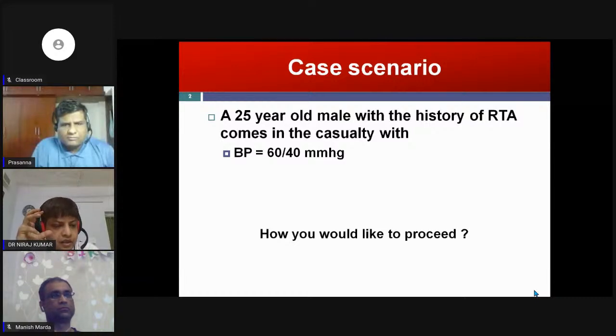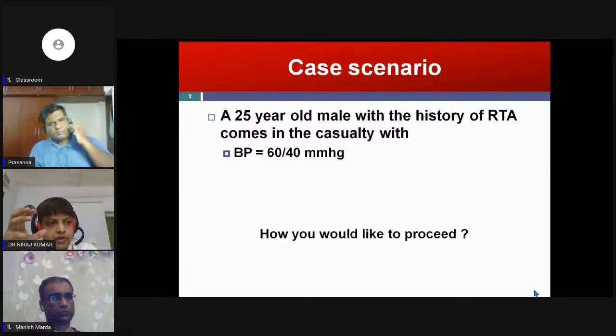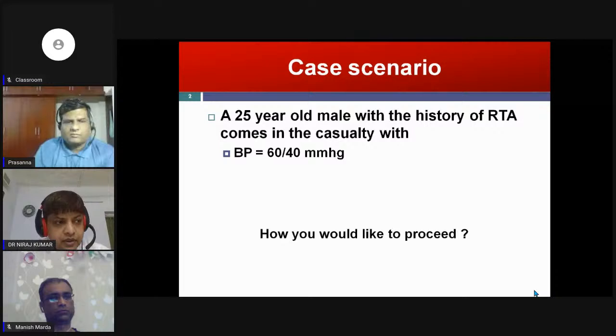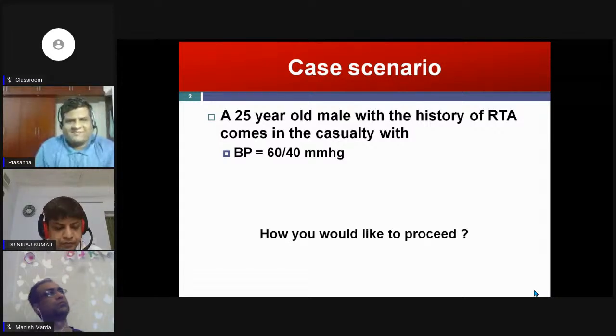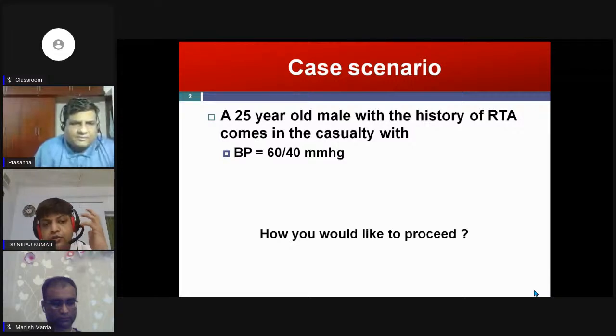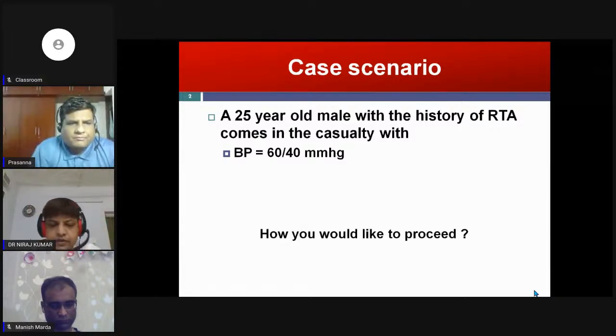But in the emergency condition, when patient is in shock, what is the cause of shock? It is something we have to evaluate quickly, and even for the most experienced person in ICU or OT or emergency, it is very difficult to find out what is the cause of shock. The traditional way of doing physical examination and taking history will be misleading in such a situation. So ultrasound has an answer here.